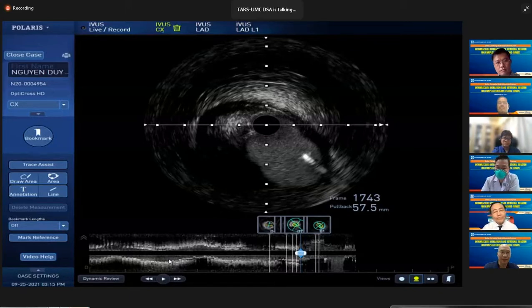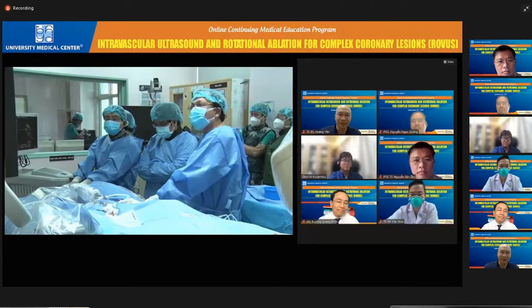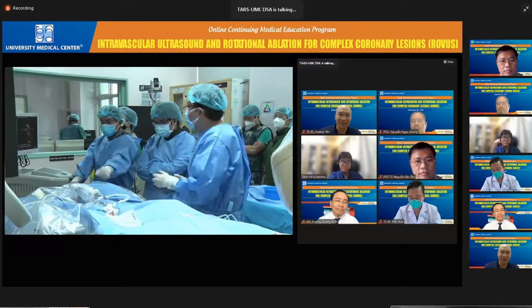So if we use the two-stent technique, maybe we have a suboptimal result for the ostium of either the circumflex or LAD. I wonder about one or two stents, but at the beginning I thought about the two-stent technique, DK crush. So okay, I will try to DK crush in this case.